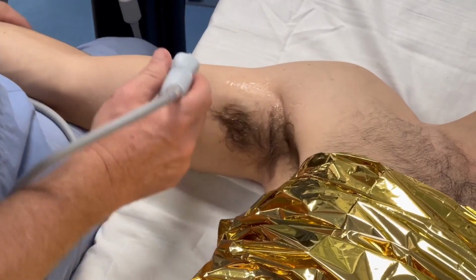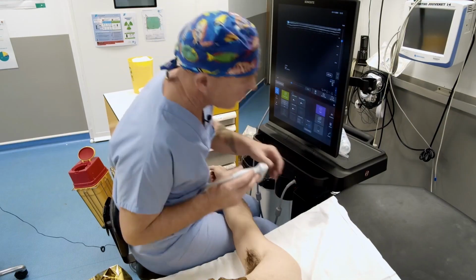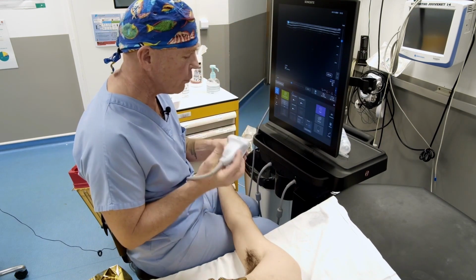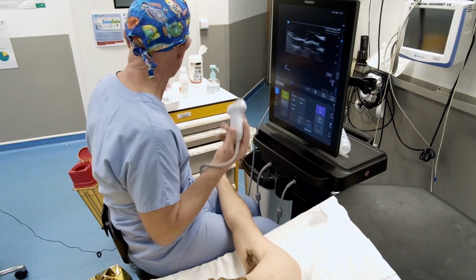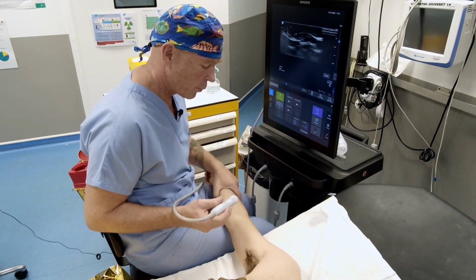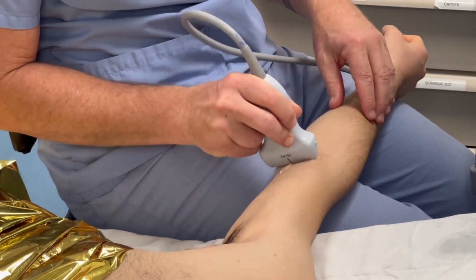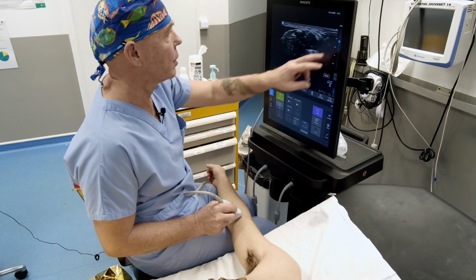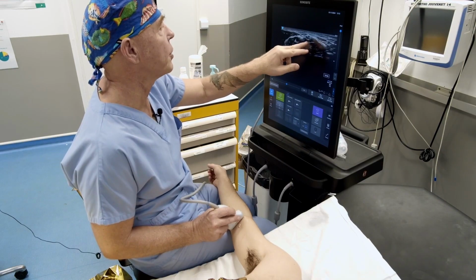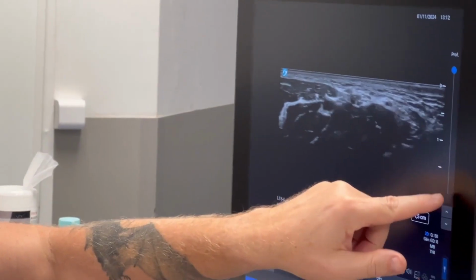We're going to take advantage of this position with the additions at the elbow. Now, this is very important and very interesting. I'm going to take my gel, simply because you keep the same position. You take the line of the elbow and you place your probe. Here, as you can see, it's the same as before. You need to reduce a little to focus and optimize your image. We can see the artery here with the median nerve. It's a bit like the image we had earlier.